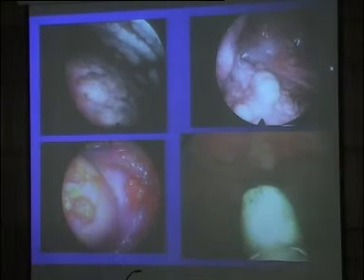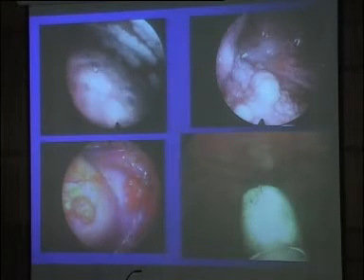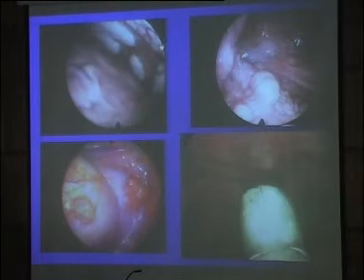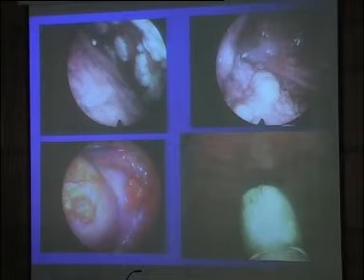And then, as you can see here, after removing all the fluid, you can get a very nice view of the pleural cavity. Maybe you saw yesterday this picture. It's an asbestos exposed patient. As you can see here, the lungs, the fissure here, the very nice pleural plaques here. What is important is not the pleural plaques, which are benign, of course, but it's a non-specific lymphangitis in between. In this case, I repeat, it was a very early stage disease of malignant mesothelioma.